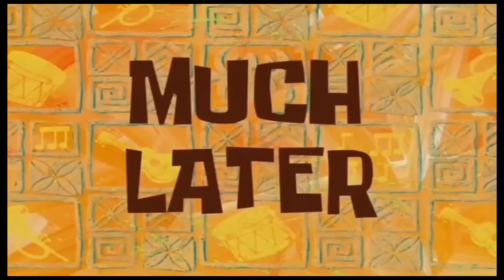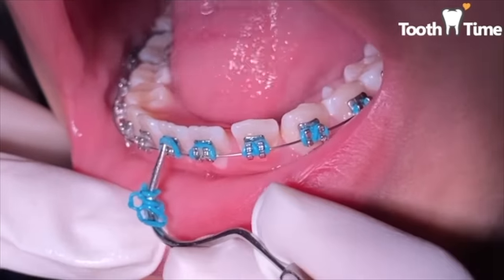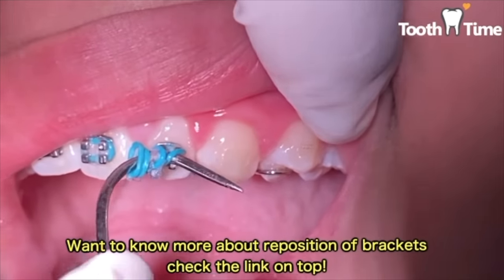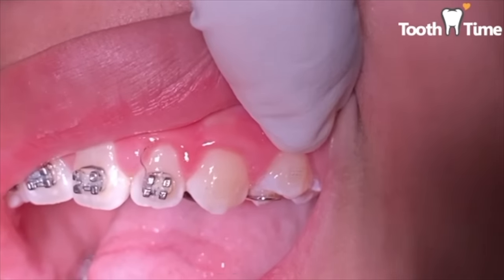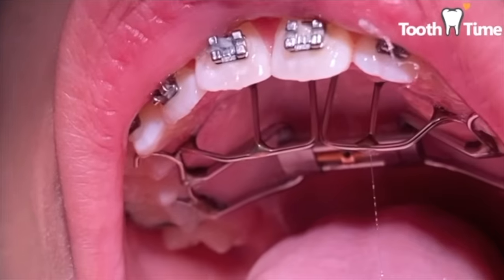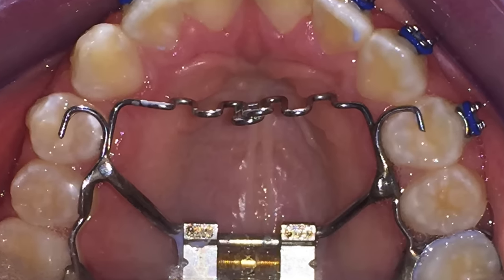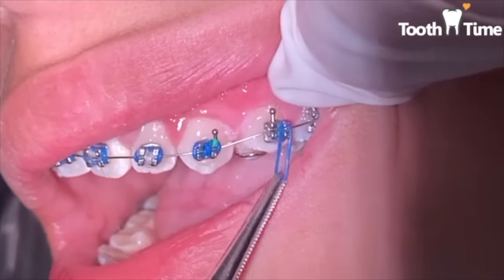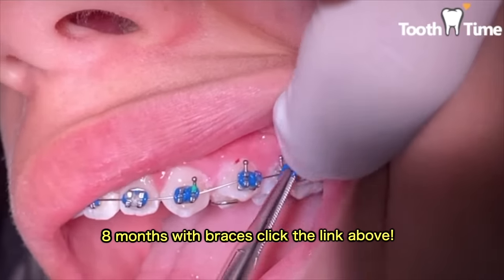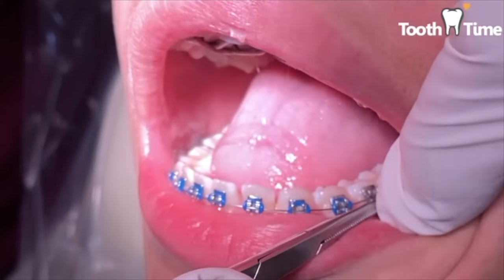Much later. So in this video, this patient, when she first started her braces, she was 10 years old. We estimated anywhere over 24 months. She wore the appliance for about 8 months, which you can see in this video. And then when she hit about the 12 month mark, we placed a thicker wire on the top and bottom. So if you have any questions on this video or any more comments, just click on the link above and it'll take you directly there.